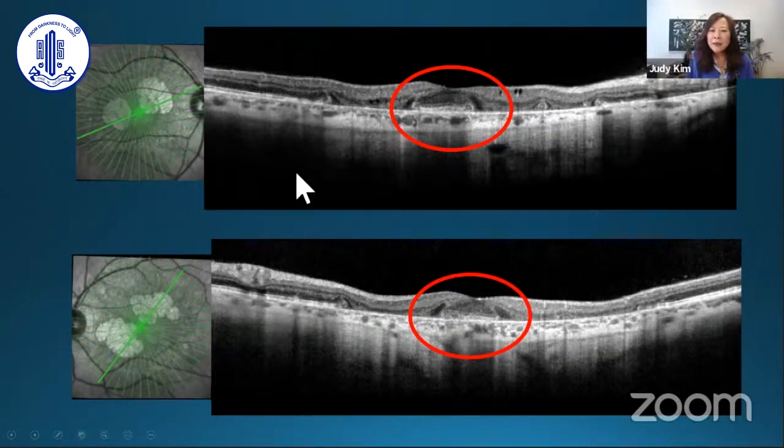And then the OCT findings, you do see some of that here, not only the atrophy, but at the edge, you could see some of these deposits between the photoreceptor and RPE layer. So it's actually on top of the RPE layer, or within, definitely above the Bruch's membrane layer. So I think they do, and they look different than drusen, where it's within Bruch's membrane. So if you look at abnormalities right above the Bruch's membrane and RPE, that's usually where the earlier cases you have.